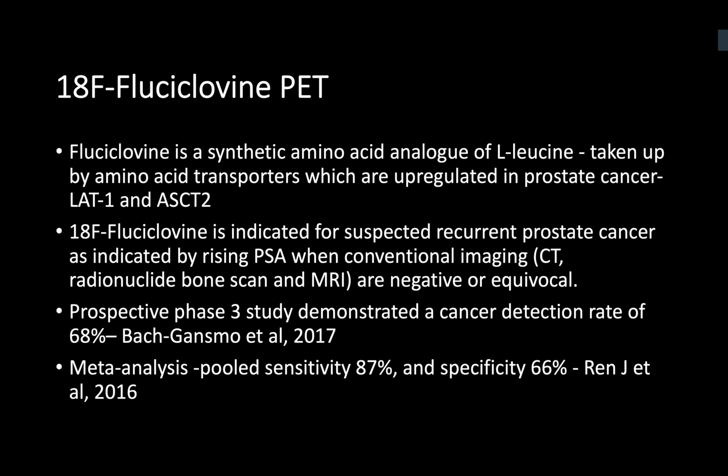Afterwards, it was Fluciclovine. You might not need to know that. I put it in the discussion only to be aware of the PET scanners that were used and then fallen out of favor. So initially FDG, if you know these 4 things, that will be good for the PET scanning part of the technology. So start with the FDG, go with the choline and the Fluciclovine.